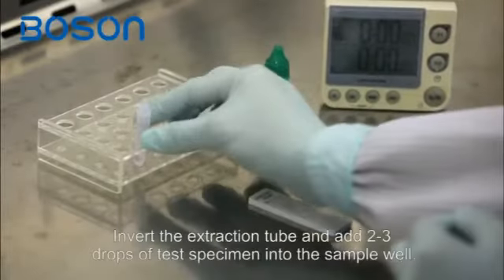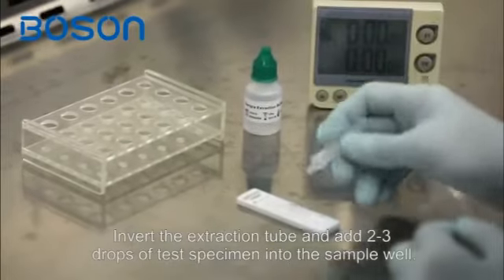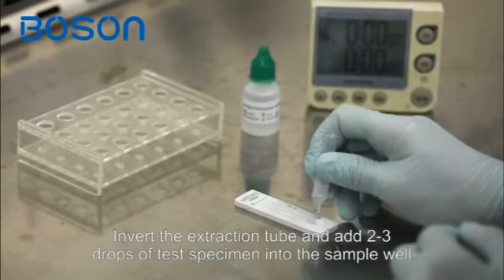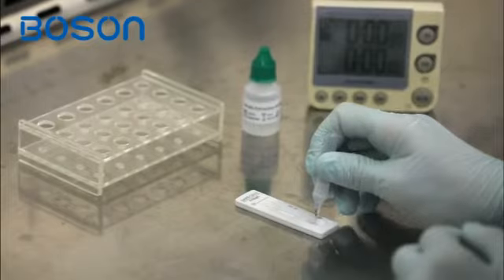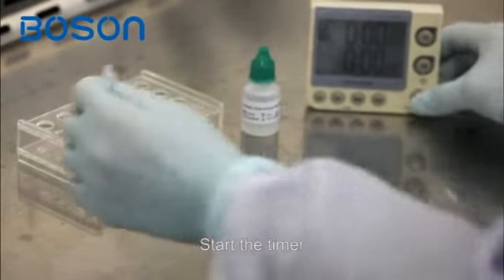Invert the extraction tube and add 2-3 drops of test specimen into the sample well. Start the timer.